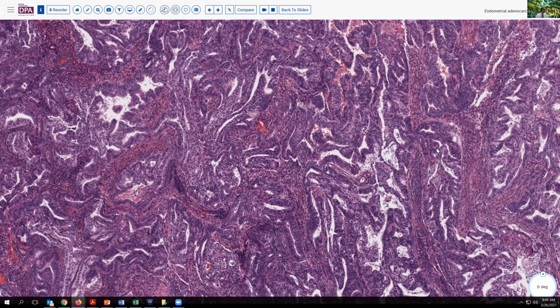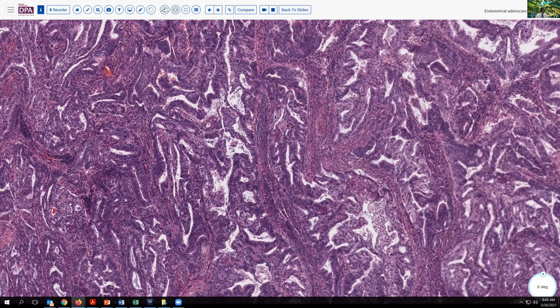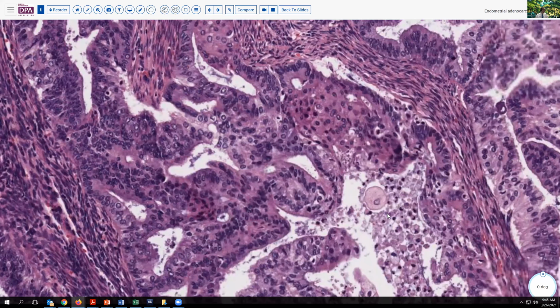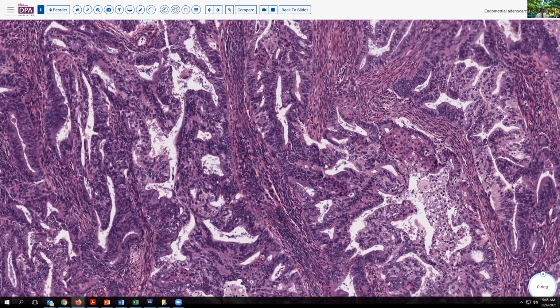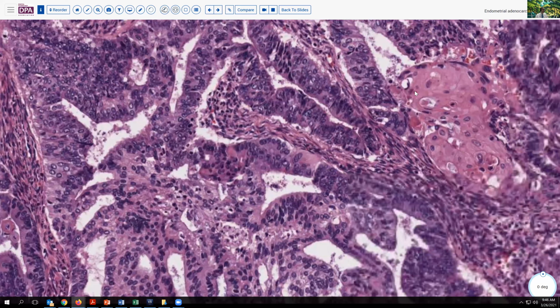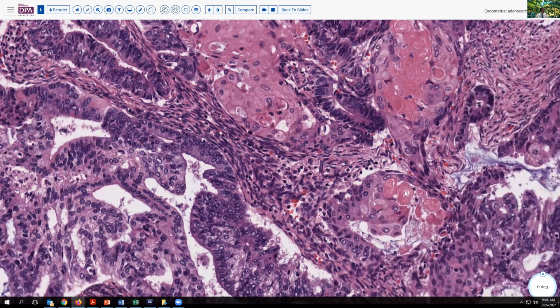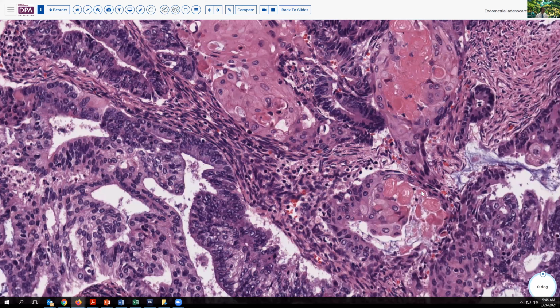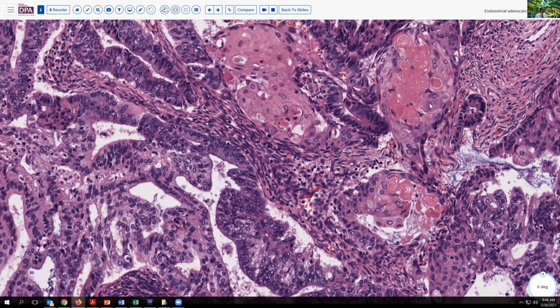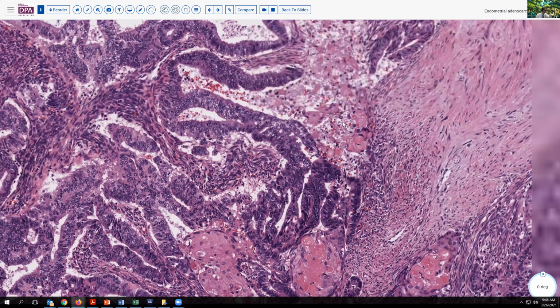And areas of the tumor showed little clusters of squamous differentiation, such as right here. We can see a nice little rounded keratinized cell, a few others here associated with that. And then in a few areas, we see nice keratinized squamous epithelium here. And this is, I think, perhaps the clue here, we also see these little keratin pearls that have lost viability. They essentially have become necrotic or completely hyalinized, keratohyalinized, and matured. Interestingly, many of these were down near the deeper portions of the tumor, not so much on the surface.